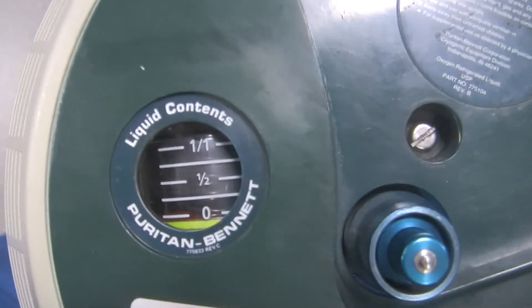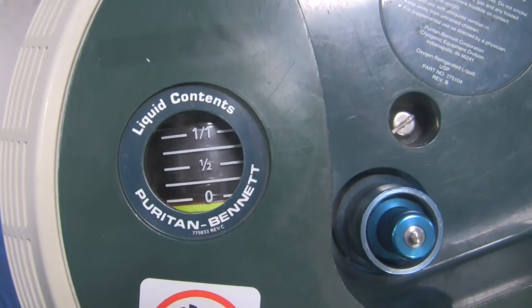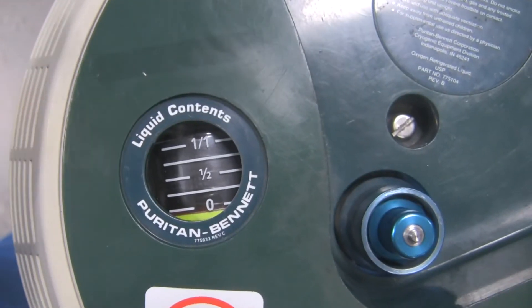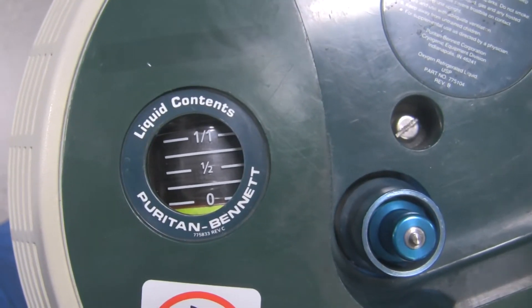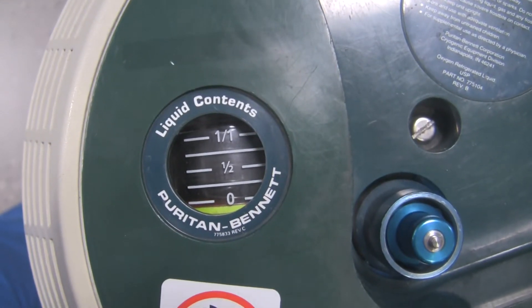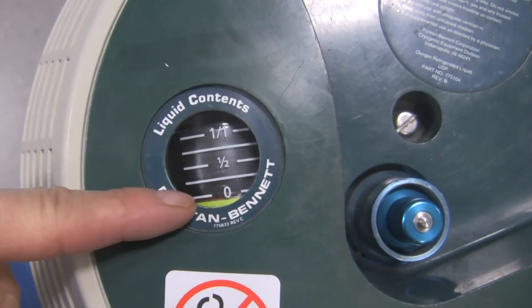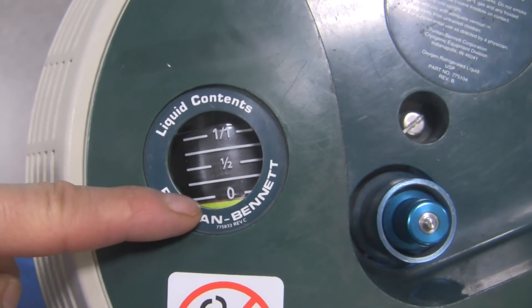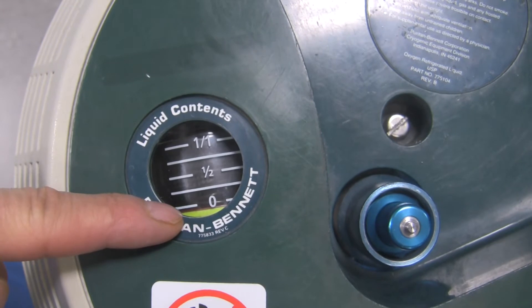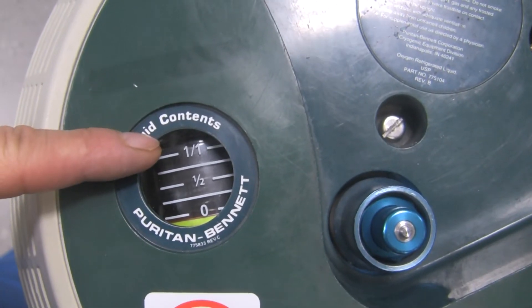This right over here is the contents gauge — it tells you by pressure how full the device is. Our reservoir is in fact full because it's very heavy to move, but for some reason the pressure gauge isn't working and says zero. There's a little yellow line at zero that means it's empty. If it was working properly and full, that yellow indicator would be all the way up to the top where it says one over one.